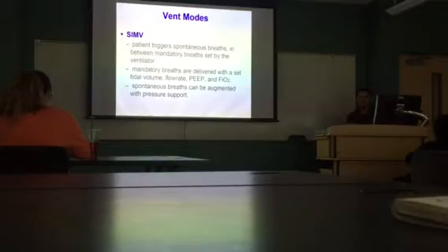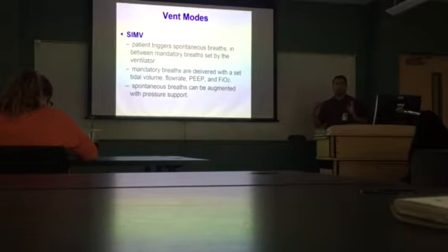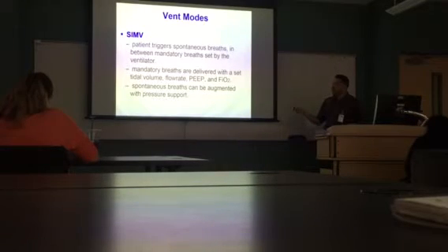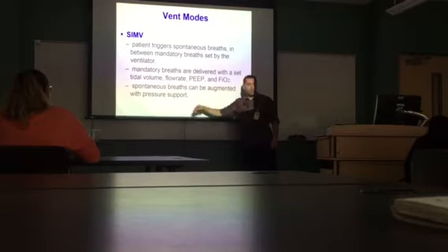Okay, then you have that second one, the one where the patient's getting better. Patient's getting better, you don't have to fully control them. Patient breathes spontaneous breaths in between some mandatory breaths, right? That's the intermittent part. And the mandatory breaths are delivered just like you would anybody else: a tidal volume, flow rate, PEEP, and FiO2. And if the patient wants to breathe on their own, the ventilator does not ignore that. It allows them to have their own spontaneous breaths, and we assist them with some extra pressure support.